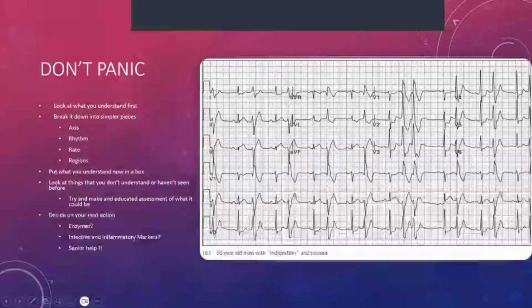What I used to like to do initially, when I first started really having to learn ECGs, was look at this particular set of circumstances. Now, the first thing is don't panic. Your patient is there, your patient is not dying. So you don't have to rush to make a decision. Give yourself 5 minutes to think about it. Break it down into simpler pieces.